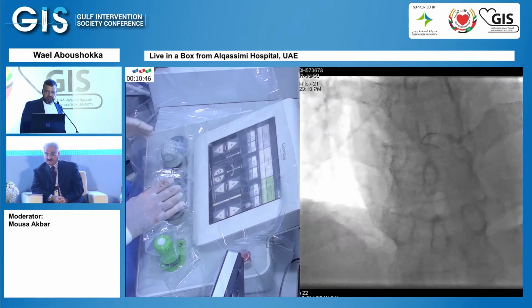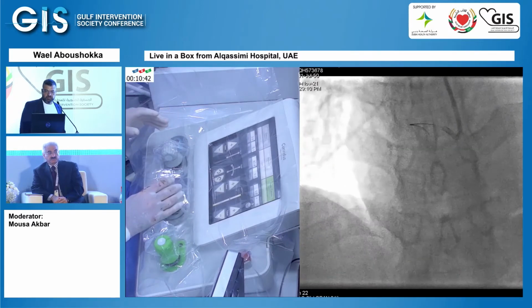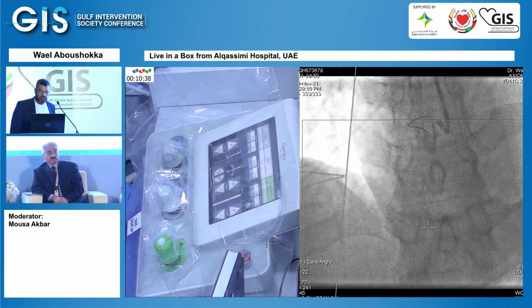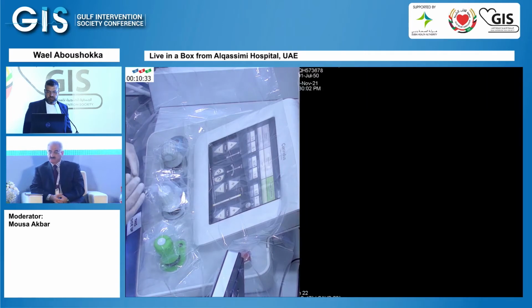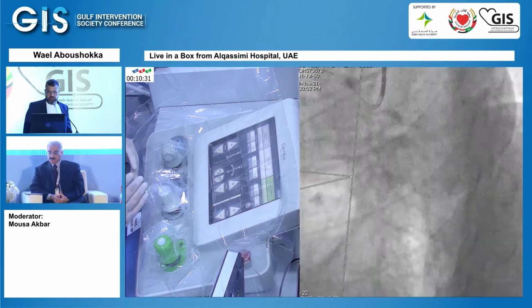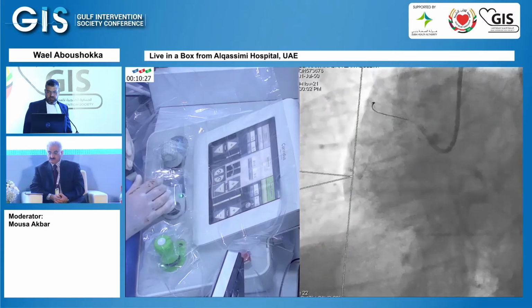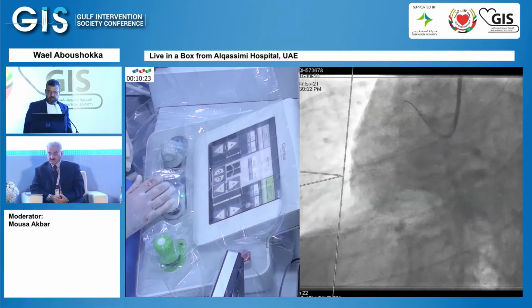Small test. Okay, spider view, please. Small test, please. Okay, so now we get a better idea.